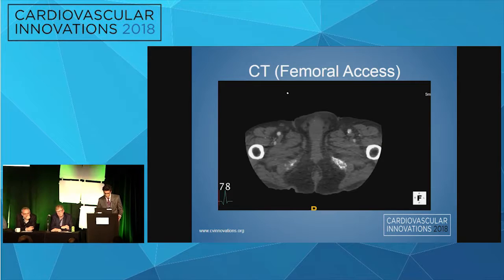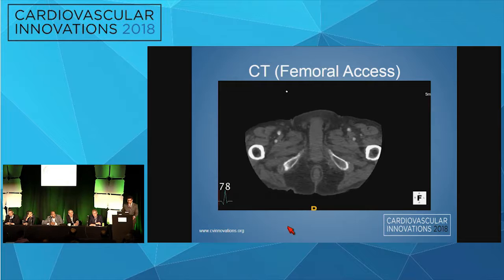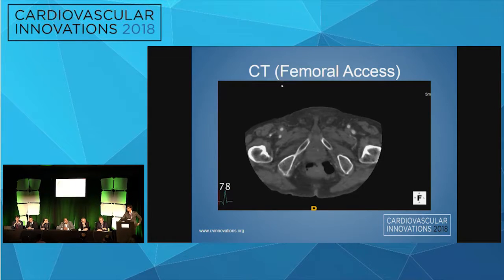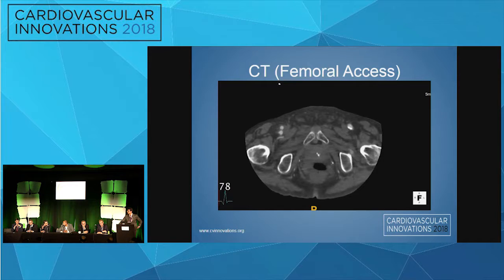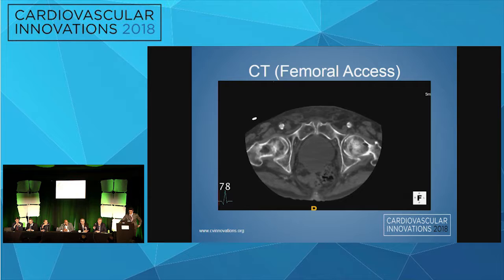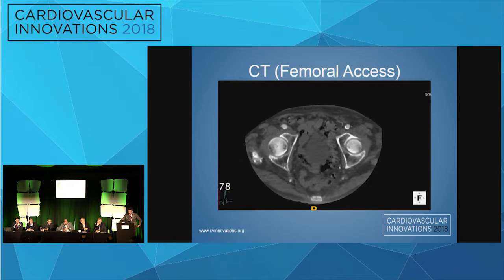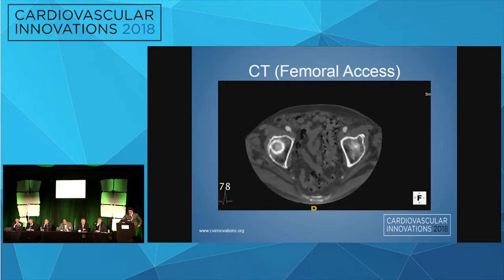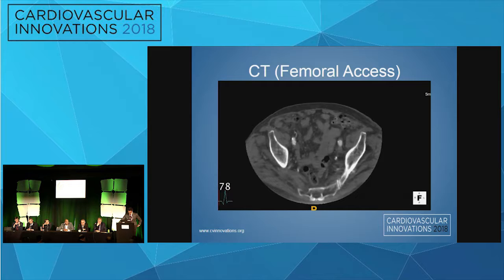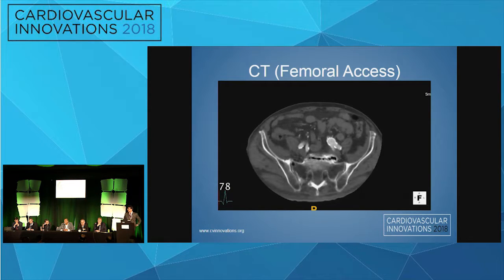See if that plays again. It's not too bad, it's access. I'll just play the multiplanar reconstruction again. I have a simple solution for that, because if they can do EVAR, you can do a TAVR, because you're more sophisticated and smaller size. Here, at the top of the femoral head, the anterior portion of the left femoral is okay. I think with cut down and suturing, you can just go above it.